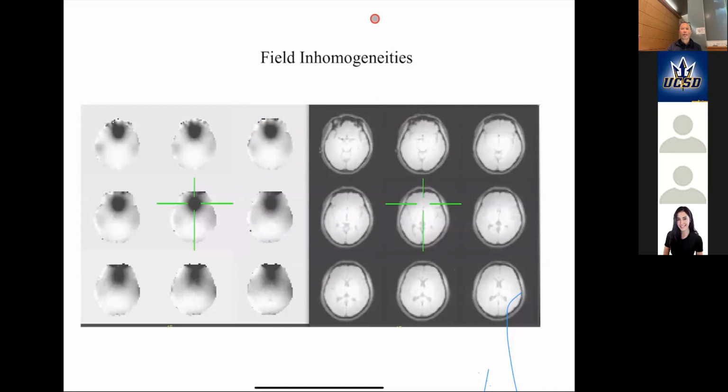So you have these big air pockets here, which are good because they make your head a little lighter. Otherwise, if you had bones here, your face would be much heavier. You think of your head as a uniform thing, but you've got these big air pockets in it. Those air pockets are where there's going to be a big difference, because air and tissue have different susceptibility. So around those areas, you're going to have a lot of change.